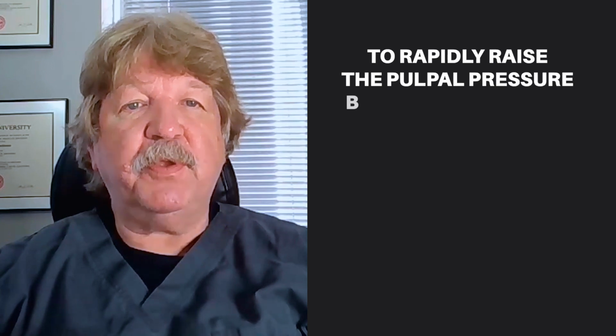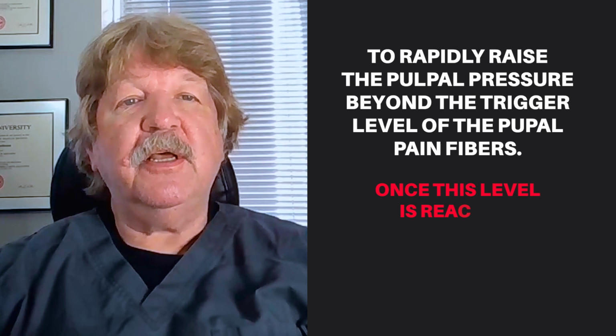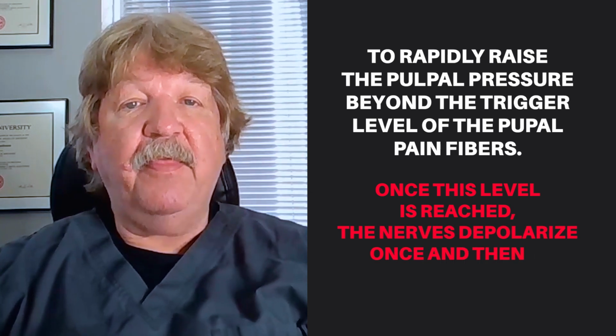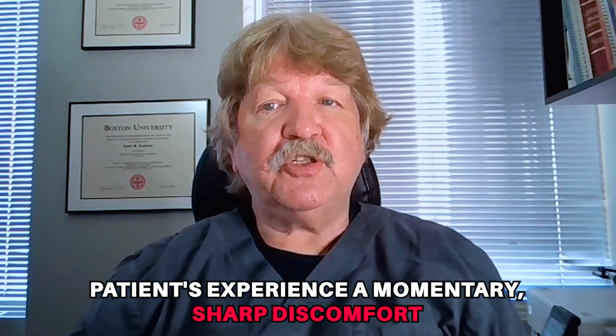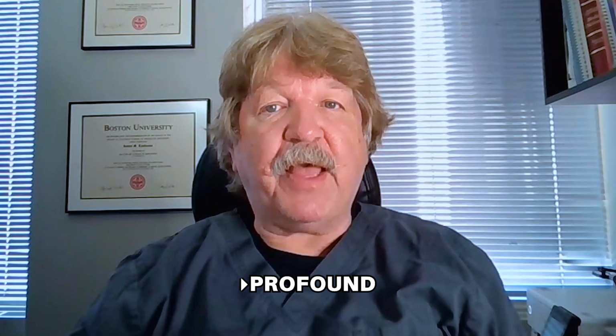The theory behind intrapulpal injection is to rapidly raise the pulpal pressure beyond the trigger level of the pulpal pain fibers. Once this level is reached, the nerve depolarizes once and then is rendered unresponsive. Studies have shown that this can be accomplished with any liquid, such as saline. Anesthetic solution is generally used because of the convenience of applying it via the needle and syringe. There is no question that the patients experience a momentary sharp discomfort. In cases of a hot tooth, especially lower molars, the anesthesia achieved with this technique is profound and immediate.